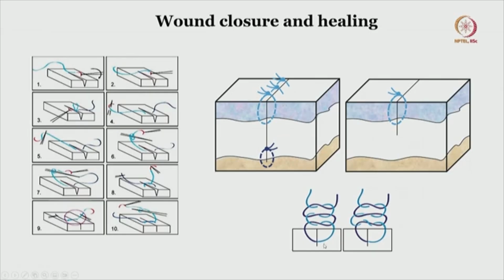Alright. So these are examples of simple sutures. If there is a bleeder within the muscle, you can take 2 or 3 throws using the needle holder, as you can see here. Make a loop using the needle holder and then pull the tip inside it, so that one throw goes on top of it. Similarly, repeat the same step with another 2-3 throws and then make a final knot.